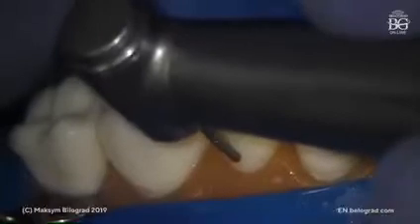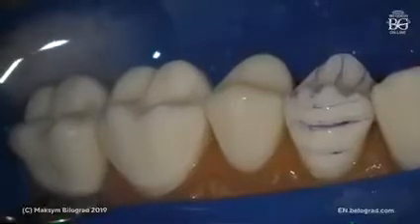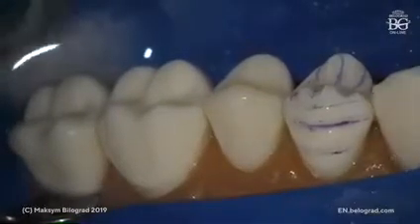You have to keep your burr really parallel to the surface that you prep, because sometimes, trying to make the finish line, people make this straight angle like you see on the screen, but it will be a mistake, because within a few seconds you will get the hugest undercut in the history of dentistry.